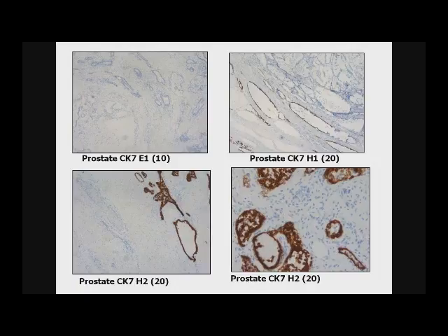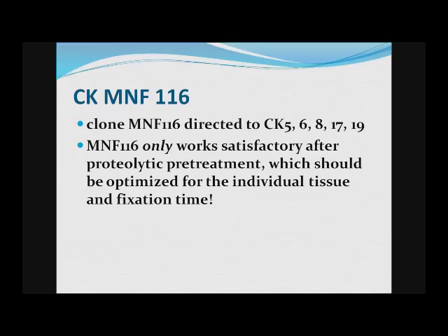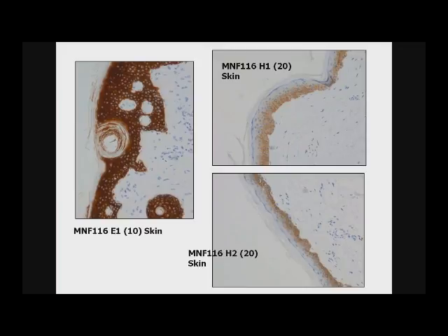And these are reasons why you want to test more than one avenue to make sure that it's going to work. But if you're looking at CK-MNF116, it works much better with the enzyme. And the enzyme 1 for 10 minutes on skin really, really highlights the skin. It does not look so good with the citrate or the EDTA.